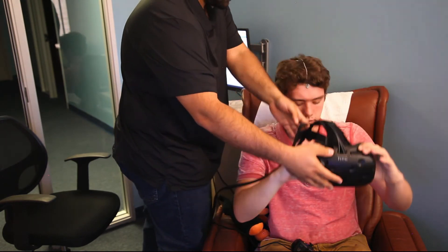And that's the new VR. You saw me taking off the headset there — it is cool. We're using it here and people really, really like it. Thank you so much. I'm Curt Othmer.